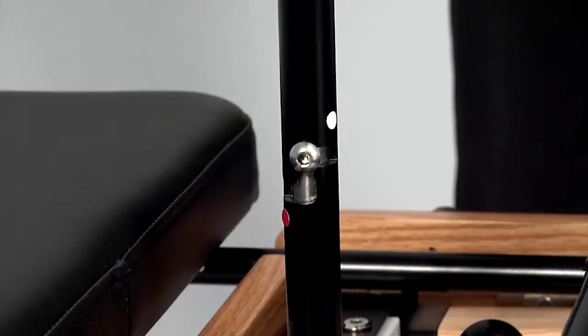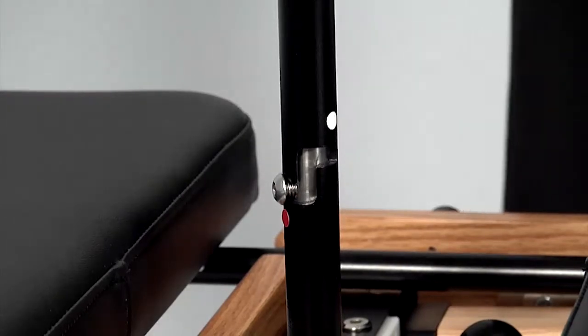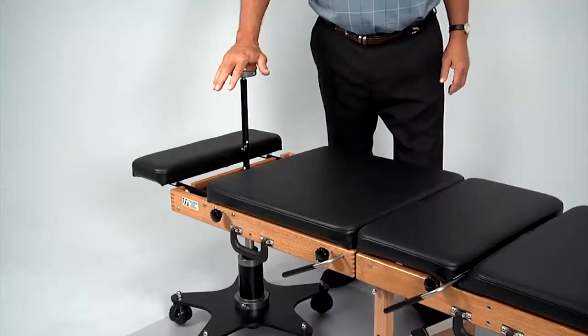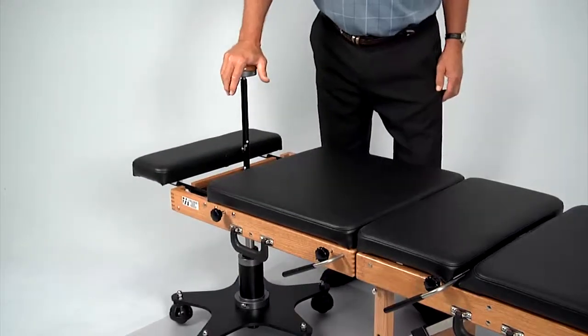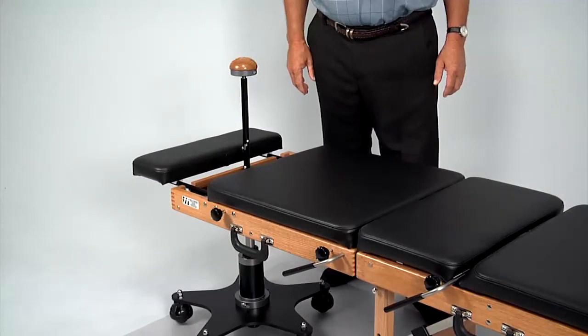To activate the flexion distraction device, turn the knob clockwise, press down, and turn clockwise again, moving the position indicator button to the red position. The back half of the table can now be flexed vertically by pushing down and releasing the control knob.